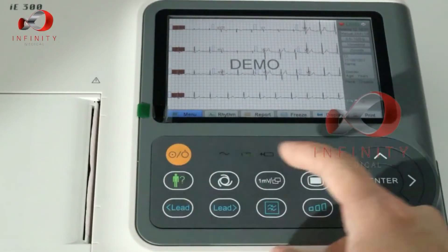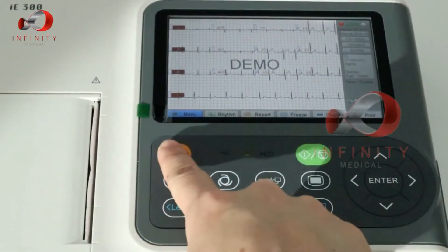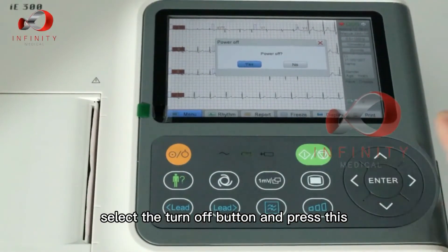To turn off the machine, always return to the main menu, select the turn off button, and press yes.